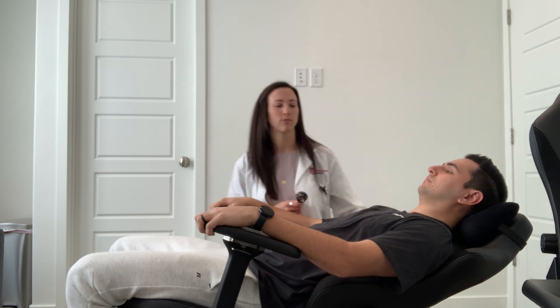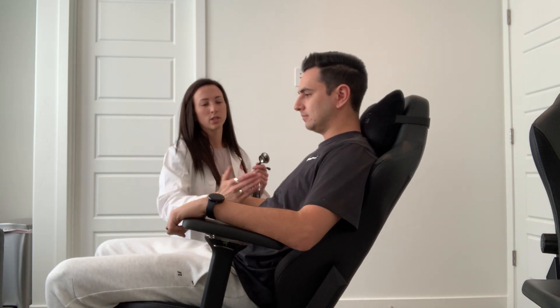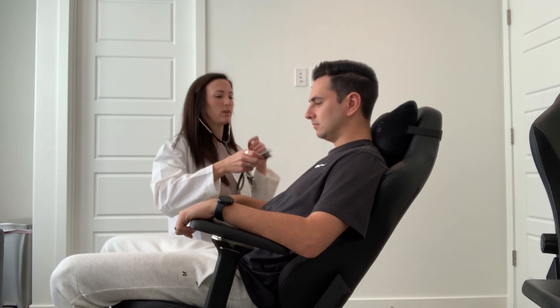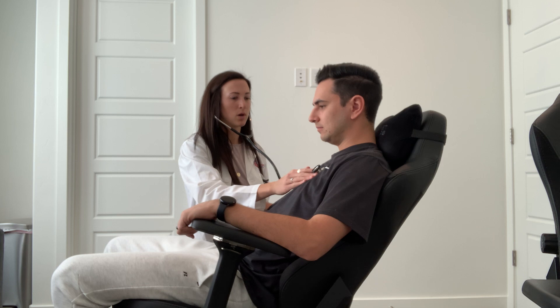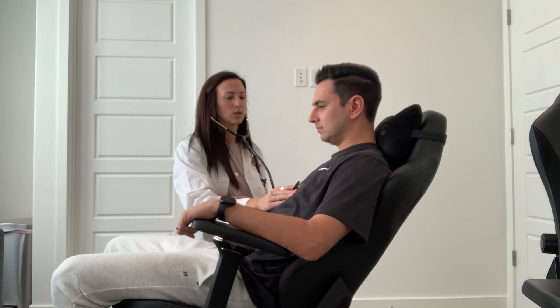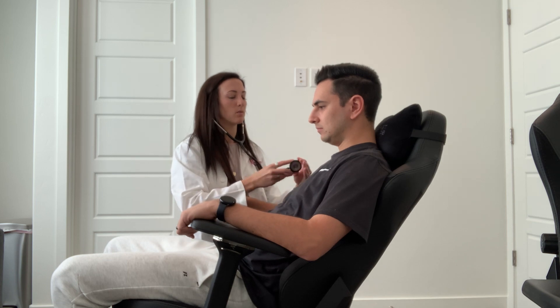Go ahead and sit up for me, Shane. Also, if you're trying to feel for the point of maximal impulse and can't quite feel it, you can have the patient roll to their left side — it will lean the heart against the chest wall so you can better feel it. Now we're going to do the auscultation sitting up as well: aortic, pulmonic, tricuspid, mitral, tricuspid, Erb's point, point of maximal impulse — and then the same thing with the bell.